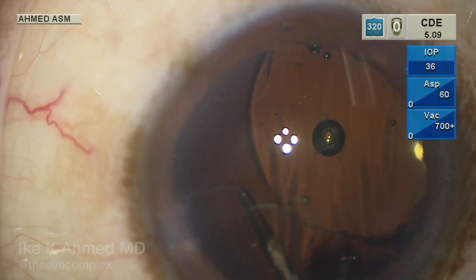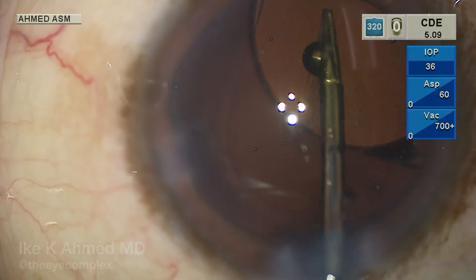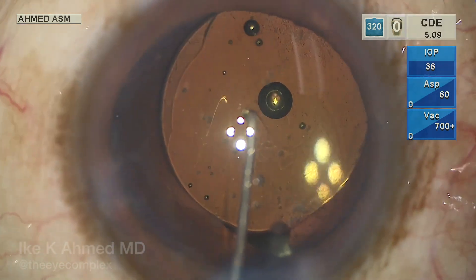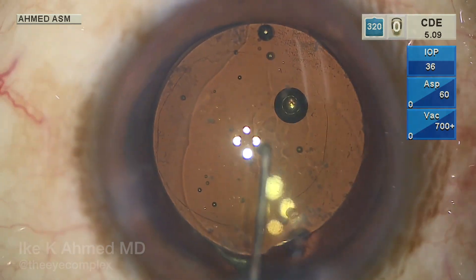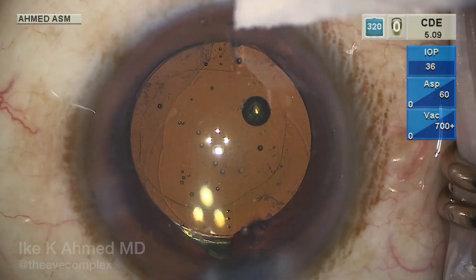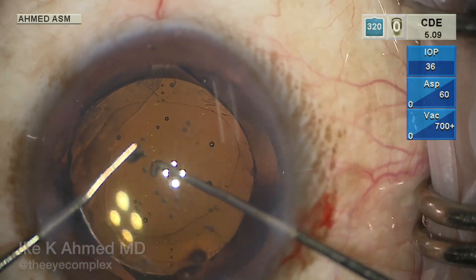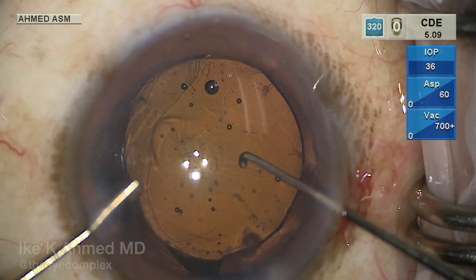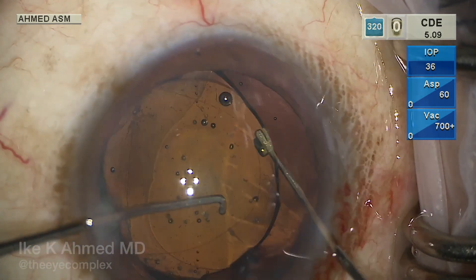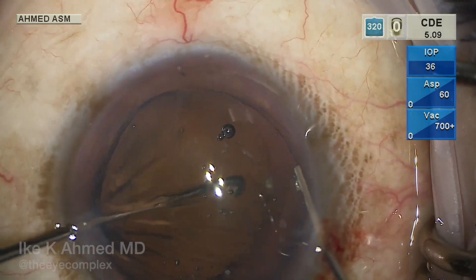For this posterior capsulorhexis, we want to make it about four and a half to five millimeters — not too large — and centered. This is successfully accomplished. The one-piece lens, which must remain in the capsular bag and should not be placed in the sulcus, is repositioned with haptics in the bag and the optic currently within as well. Hooks are used to prolapse the optic through the posterior capsulorhexis. The rhexis is reasonably round and centered, toric marks are nicely aligned, and one pole of the optic is then prolapsed behind the posterior capsule, followed by the other pole. This is facilitated using a Kuglen hook on the rhexis edge to stretch it while using an Osinski hook to push the optic through the posterior capsule rhexis, buttonholing the optic.